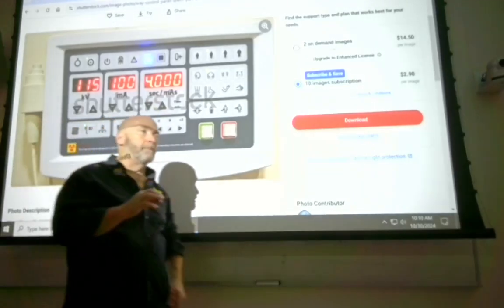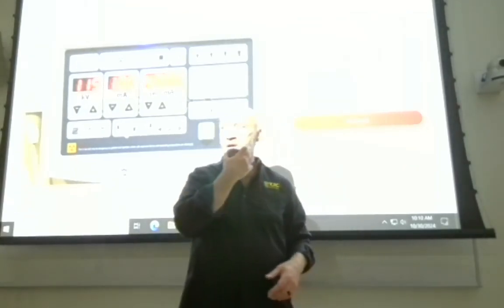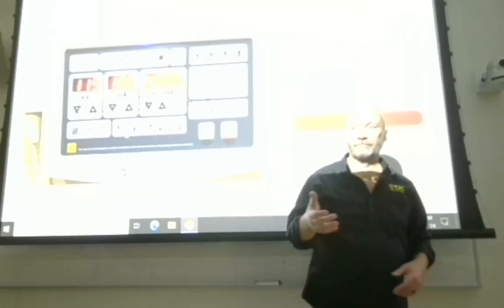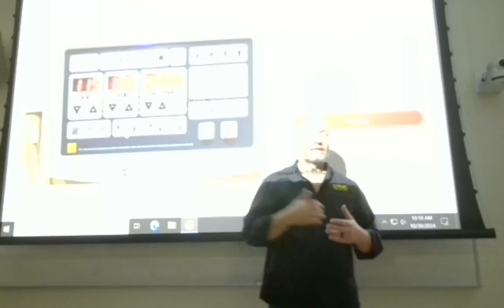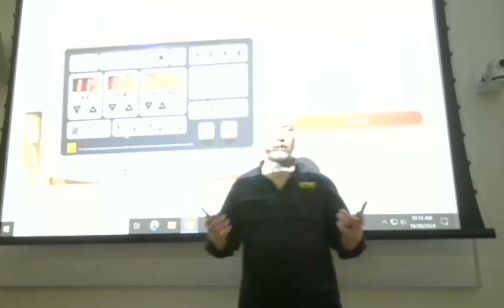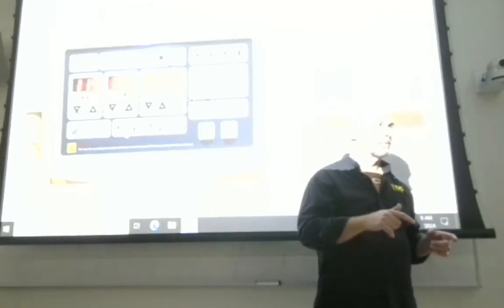So there's been a couple of times that I've referenced density controls. You remember talking about that? I said +1, -1. Sometimes, and I didn't take this into consideration when I mentioned those, those density controls are not represented by + or -1.